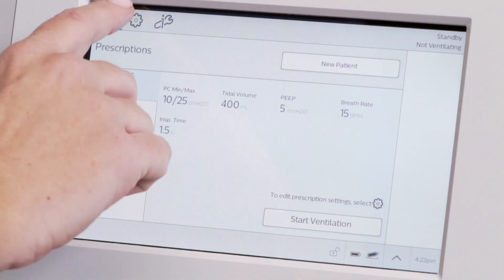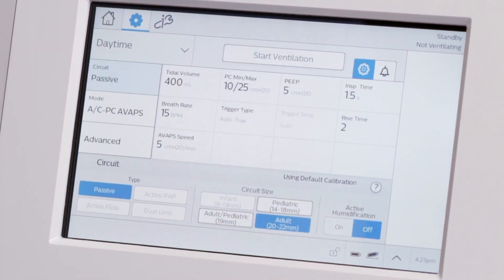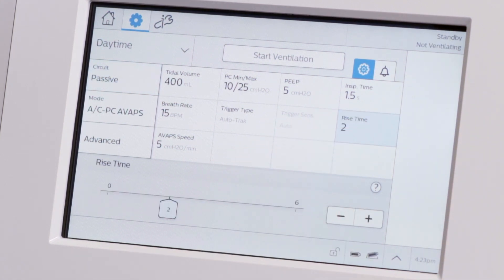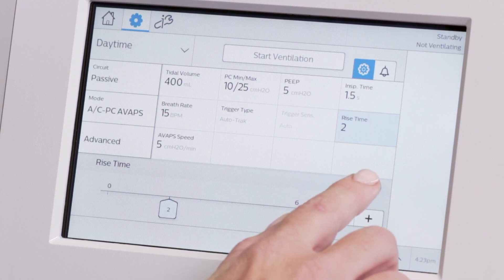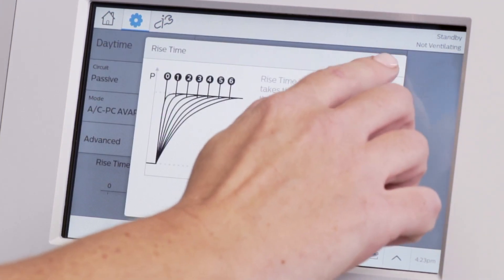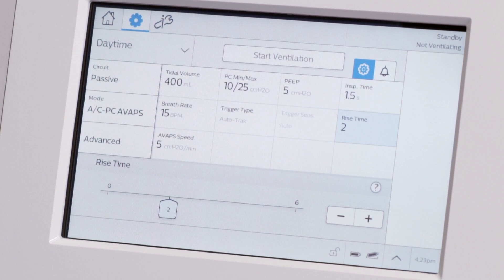Next to the home window is Settings, where you can enter prescription and alarm settings. For more clarification on a setting while entering a prescription, press the question mark icon for Help. To close Help, press the X.